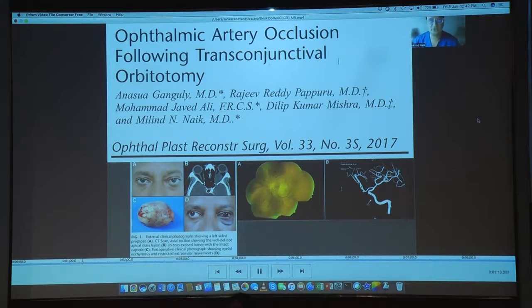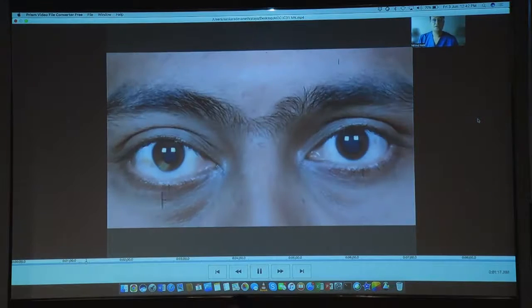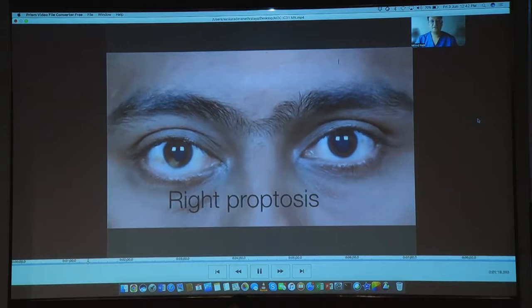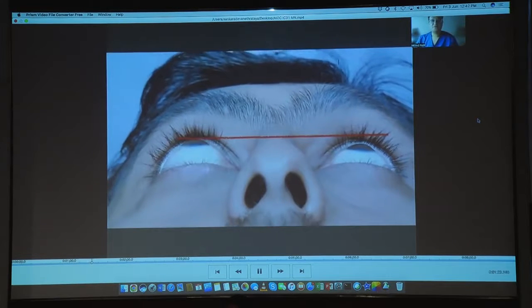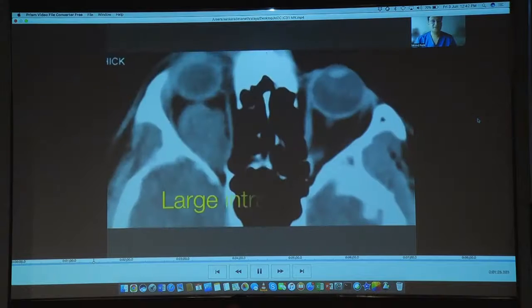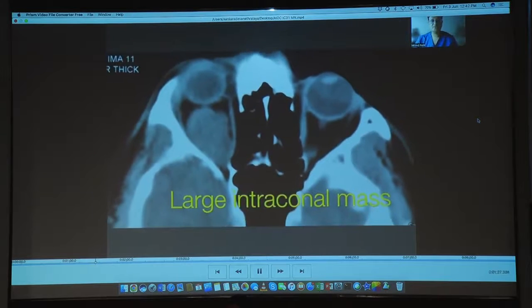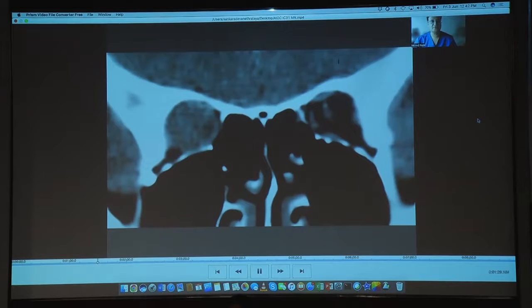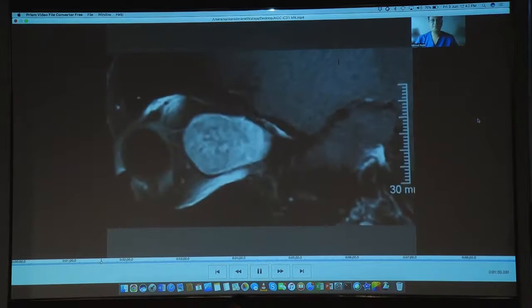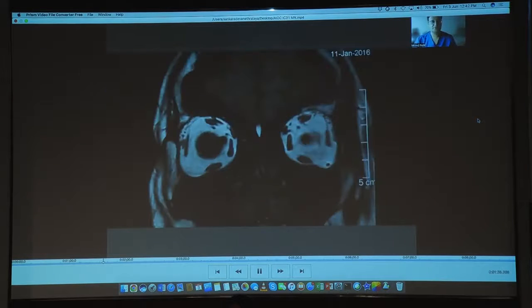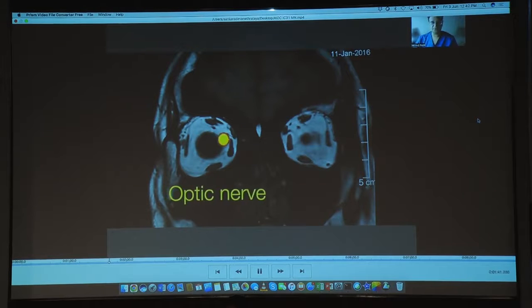This unfortunately occurred during the period when we did not have navigation. Fast forward to today's era: here is a case with right proptosis. The scans show a similar pear-shaped lesion in the mid and posterior orbit extending up to the orbital apex. We performed an MRI for this patient just to locate the optic nerve, and found it to be located superomedial to the lesion.